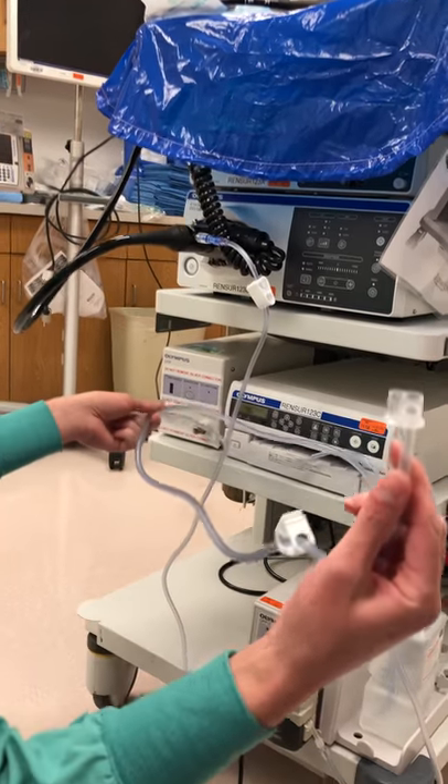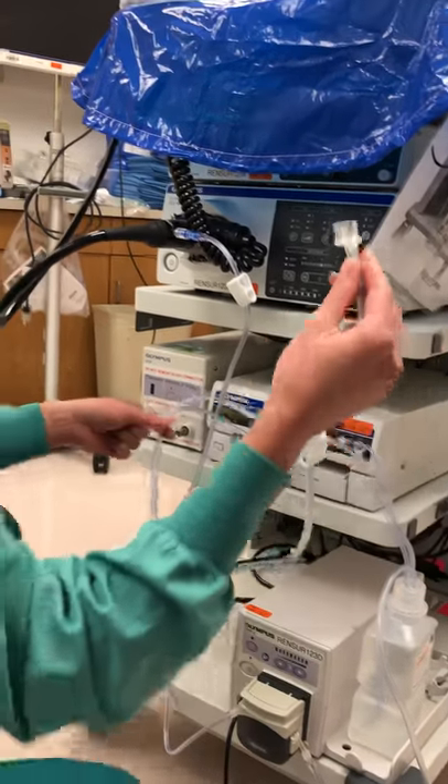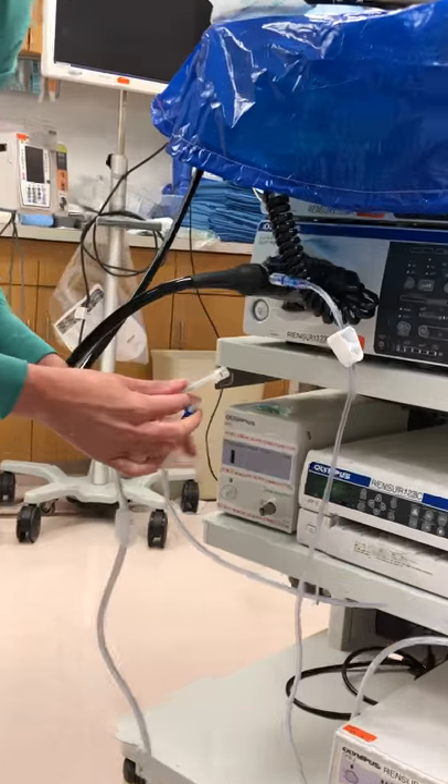This one here is going to be attached to the side of the scope. It has a perfect little two ports that are made just for this, so I'm just going to push that into place.